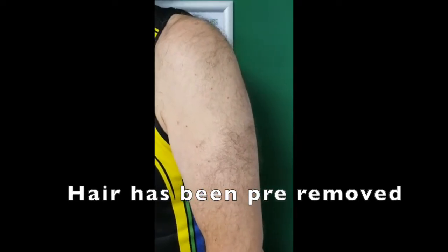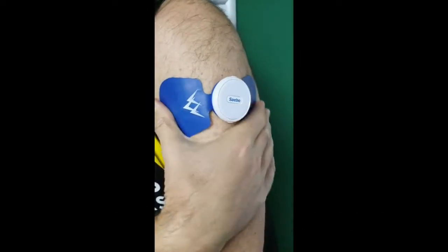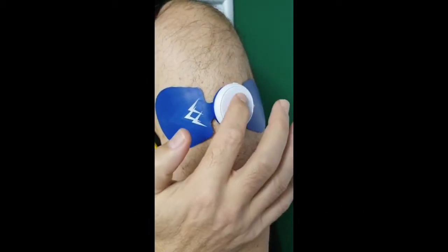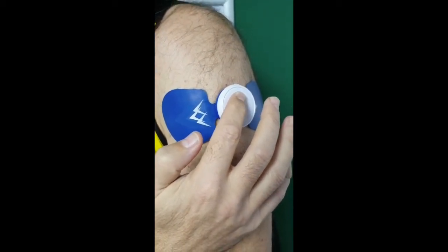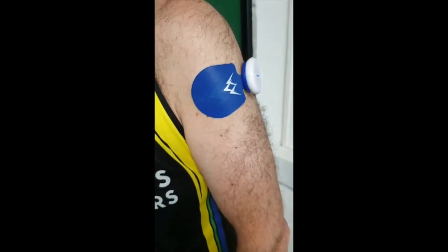For subluxation or weakness around the shoulder, you can apply it up near the top of the upper arm. Press and hold the power button until you hear a beep, then press the two dots. Turn it up until you feel the shoulder starting to lift — you can see this from the side.